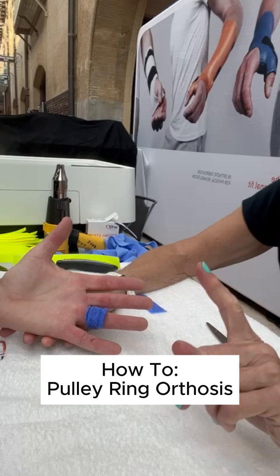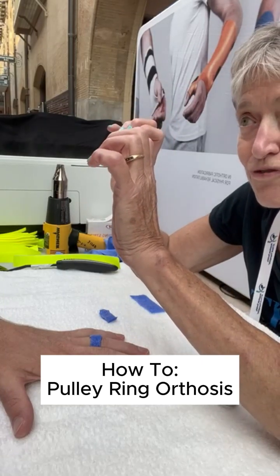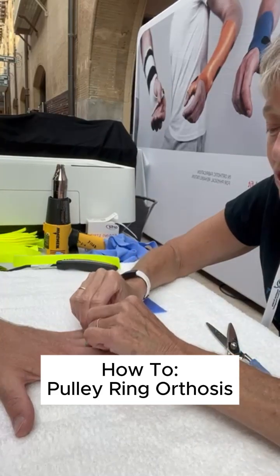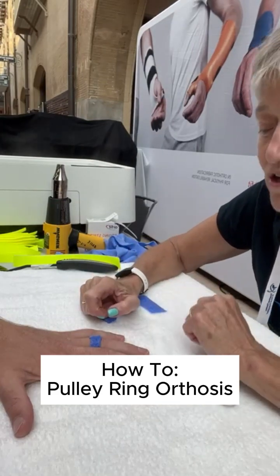What the authors mentioned was that it would break easily back here, so that in case there's an injury or you're about to fall, there wouldn't be a degloving injury — it would just separate. So they mentioned breaking it apart and then putting it back together with heat, and we can do that as well.